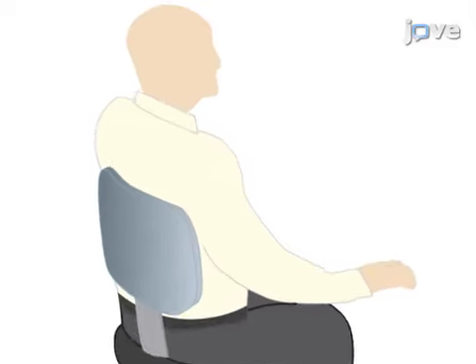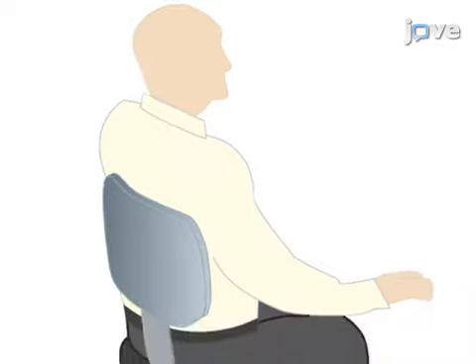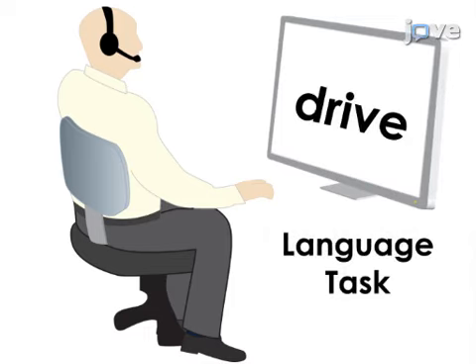The second step is to apply anodal, cathodal, or sham transcranial direct current stimulation over the cerebellum for 20 minutes in 3 separate groups of participants, or in the same group separated by 1 week. Next, measure performance again on all tasks after the application of cerebellar transcranial direct current stimulation.